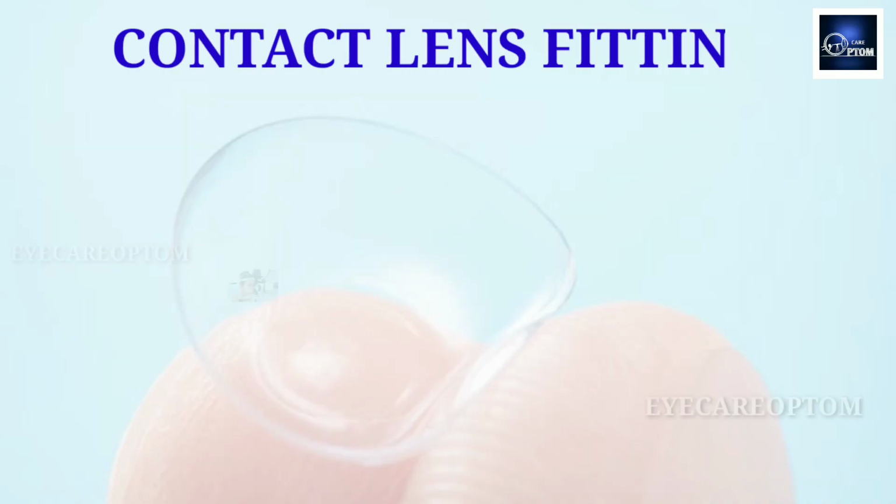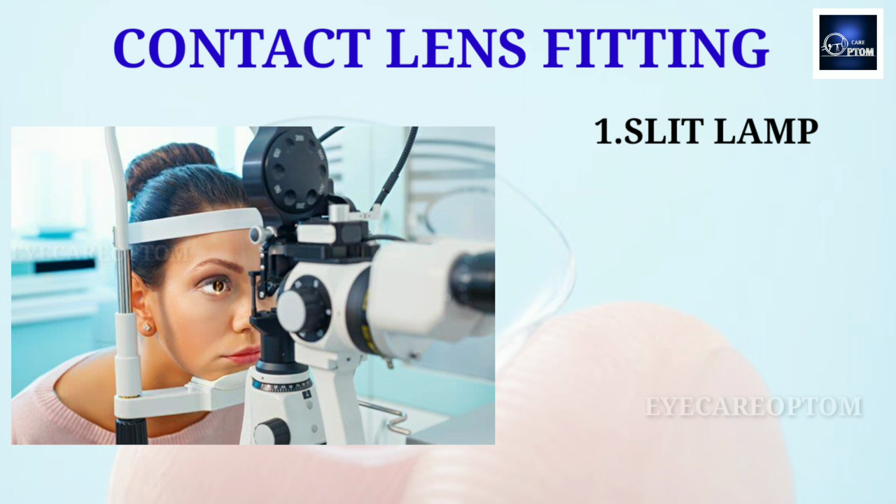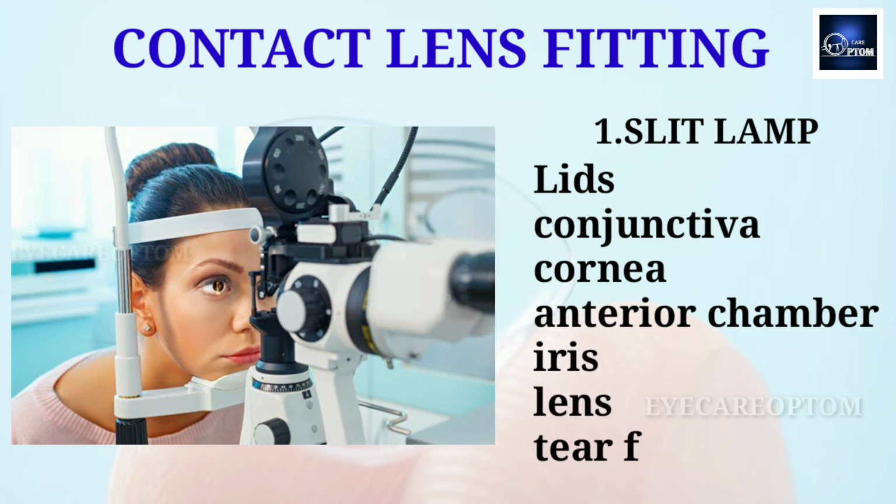The first one is slit lamp examination. This is to identify any pathology in the anterior segment or in the eye adnexa. We should check for eyelids, bulbar and palpebral conjunctiva, cornea, anterior chamber, iris, lens and tear film.